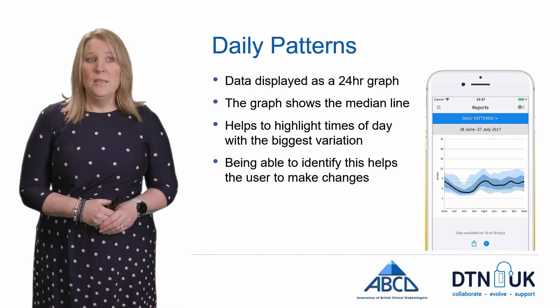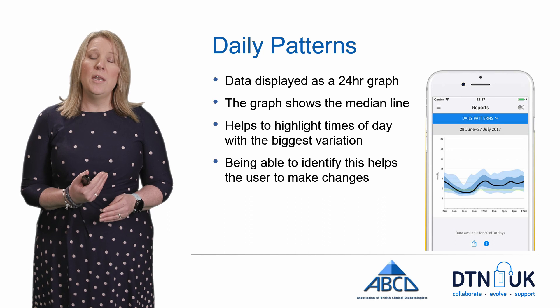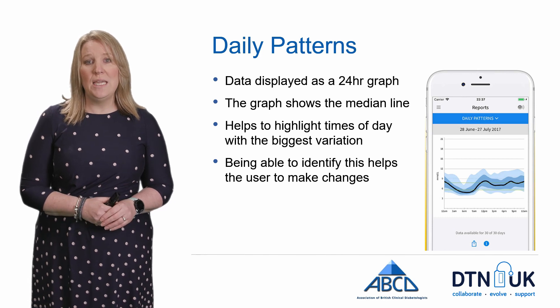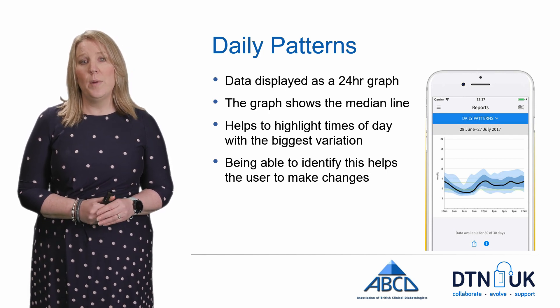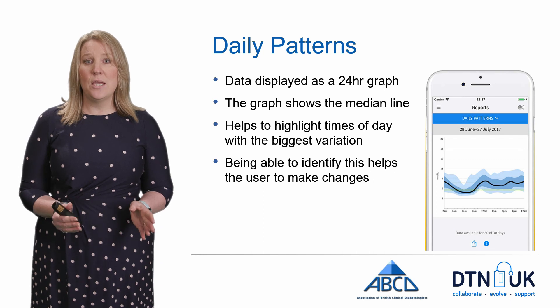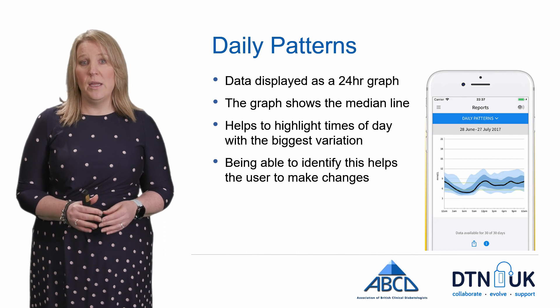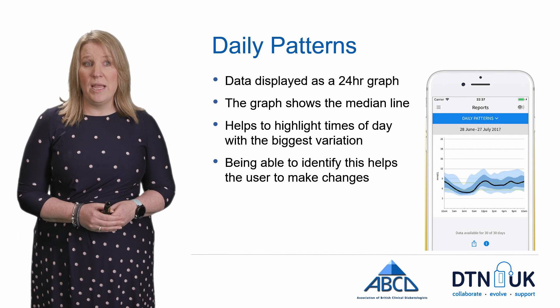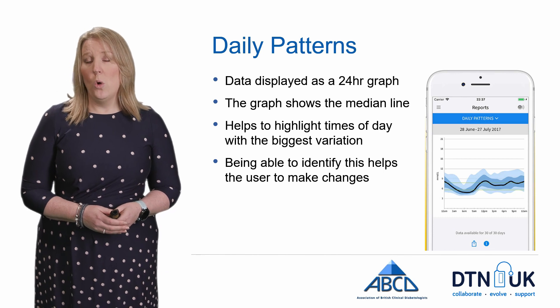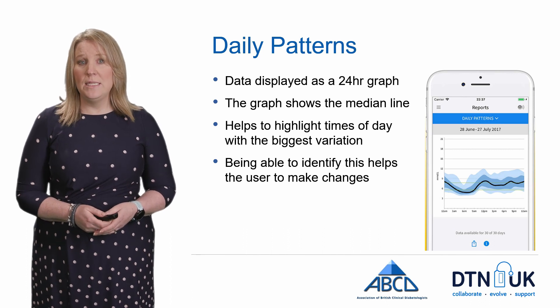Daily patterns are very similar to the daily graphs but plot a number of days — 7, 14, or 30 days — onto one graph. You can see daily patterns and trends through exercise or your insulin regimes all plotted over a 24-hour period. The graph shows the median line in dark blue against your target range, clearly showing areas of huge fluctuation or areas of hypo or hyperglycemia. These will be dealt with in more detail in other modules.